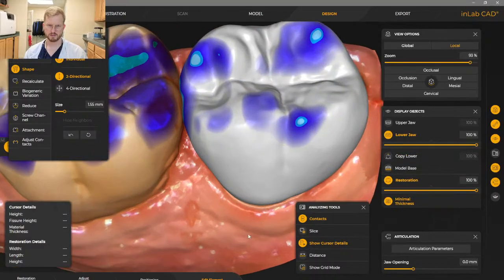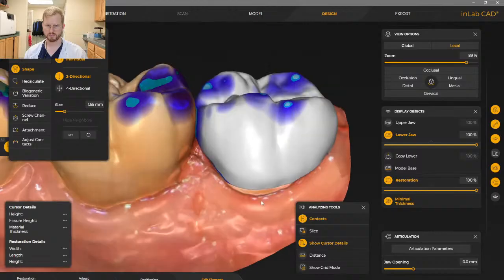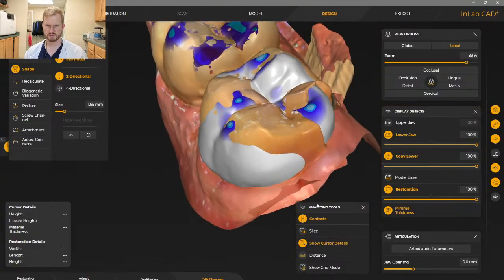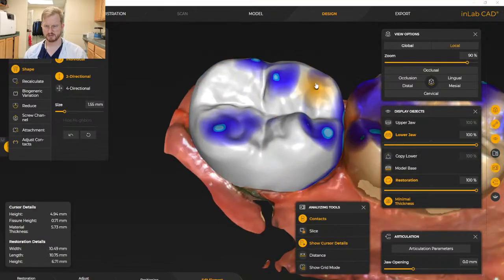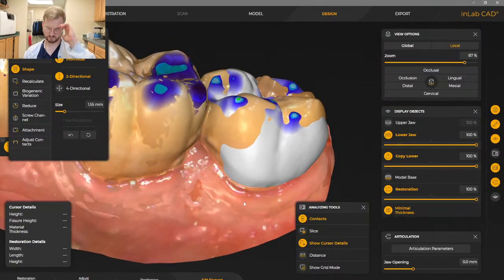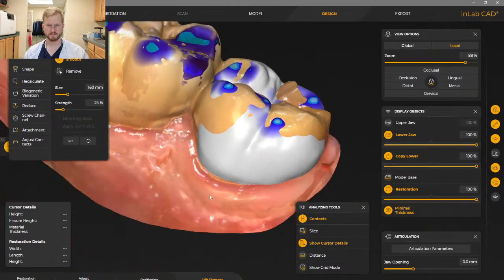It's better. About here. So you're going to want one more bite here. That's starting to get kind of tall for me. I think that's still okay. Let's see. Yeah, I think we're okay still. Let's see, do we want to try and add something here? That's going to start to be a little tall. But let's just see. Just going to smooth this so it'll flatten that cusp some. Okay.